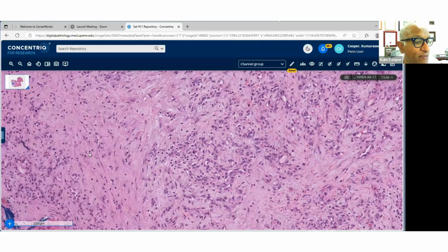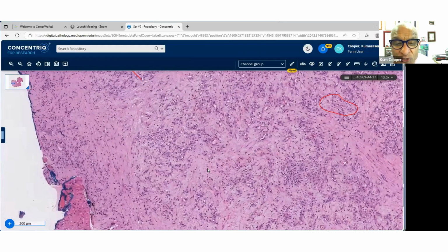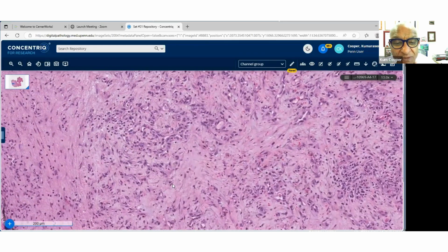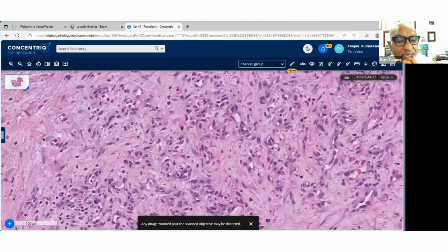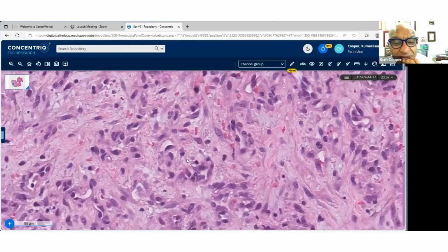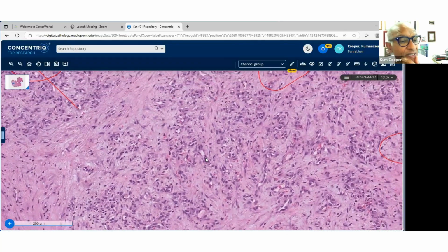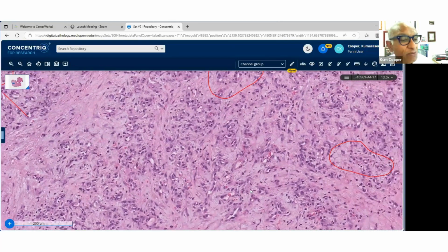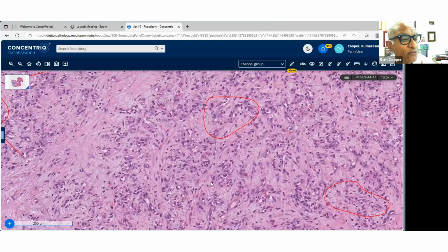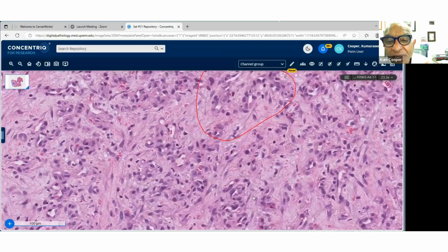Okay, good thought. And then we have epithelioid hemangioma. Again, another good thought. They also would have vacuolated cytoplasm. They can form lumina as well. Also very plump, eosinophilic, epithelioid. I'm glad everybody's going on the vascular route because it is vascular. So I'll share that with you. Now, here's the piece of information because I've got two differentials to kick off with. Anybody else have any other thoughts?